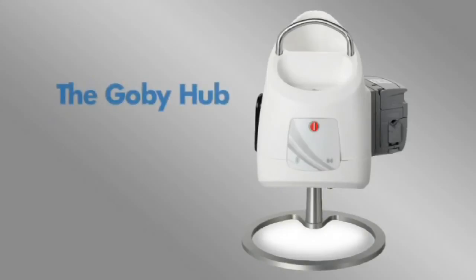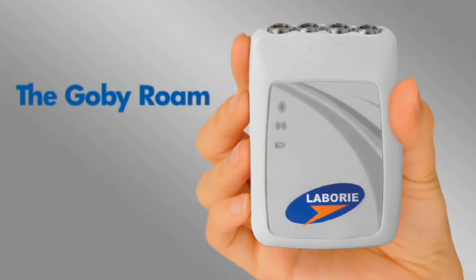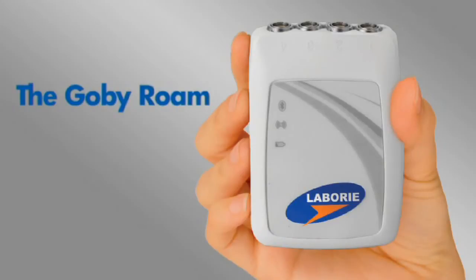The Goby is made up of the following components. The Goby Hub, which includes our pump as well as a docking station for the Goby Roam. The Goby Roam, which allows you to attach up to four air-charged transducer cables as well as EMG wires and patches.